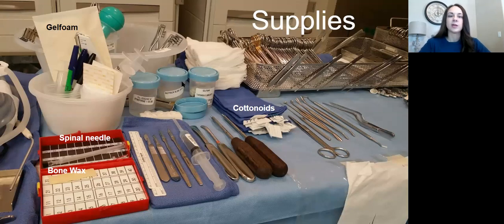You'll also see that there is some bacitracin here, 50,000 units. Some surgeons like to sprinkle bacitracin powder onto the wound before they close to just help ward off infections. They have the rest of their 1% lidocaine with epi back here. I have a spinal needle. When I get into spine, I'll explain the purpose for that, but you'll need a spinal needle sometimes on these cases. It's not a needle used for injection. It's used to help mark the spot.